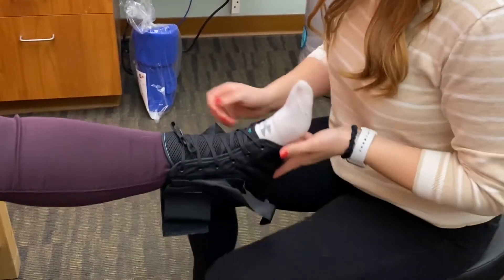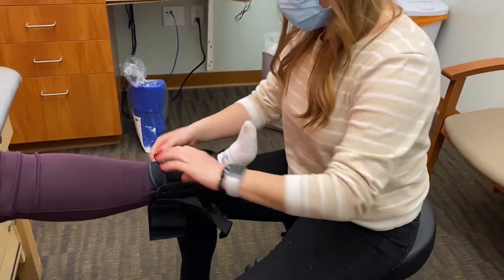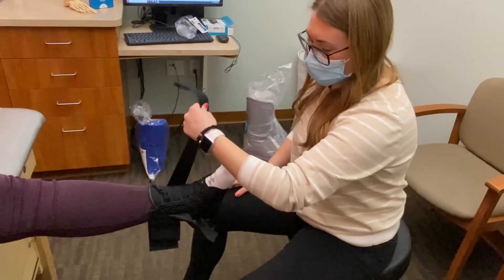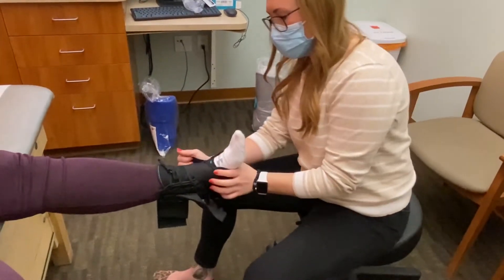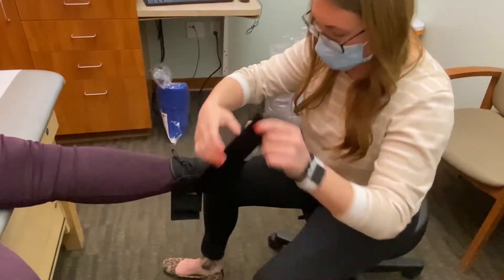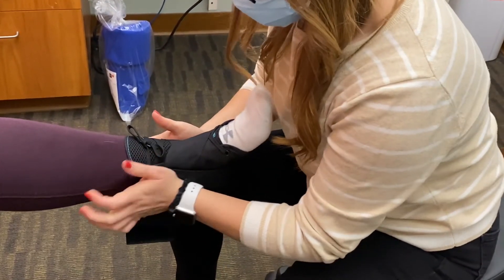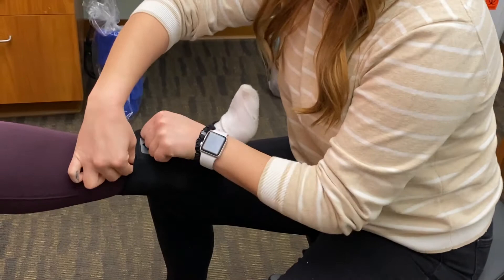This brace is designed with two straps that help with the figure-eight technique to lock the joint in place. It doesn't matter which strap you start with, but the big thing is to cross over the ankle joint, under the arch, and then up the side of the leg. You'll do that on both straps — over, under, up — and then when happy, lock everything in place at the top.